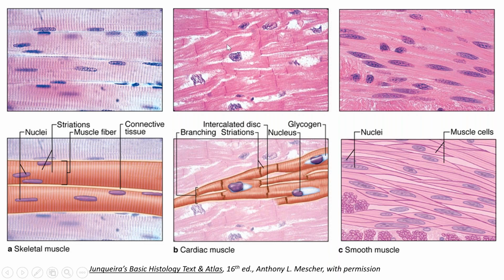In the middle, we have cardiac muscle. We have striations that are visible, but we have a round central nucleus. We may have two, but where the two ends of the cells meet, we're going to have a structure called the intercalated disc. These cells are branched. And this is one of the tissues, I think, that's probably one of the hardest to try to identify in section. The organization of cardiac muscle, because of the way it twists, you often see cross and longitudinal section, and it's kind of tricky to see when you see a lot of cross section.